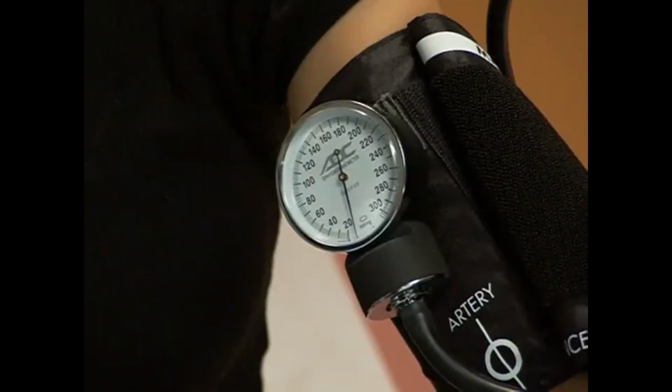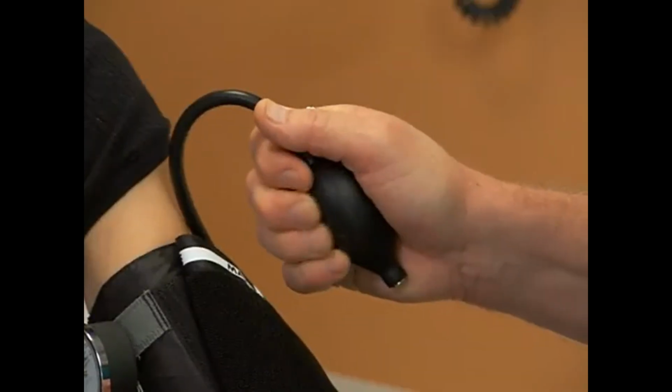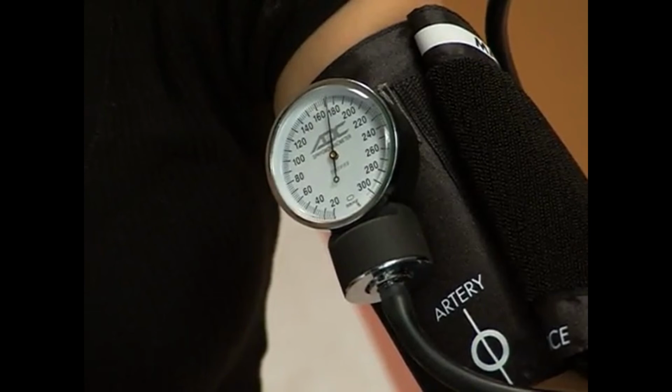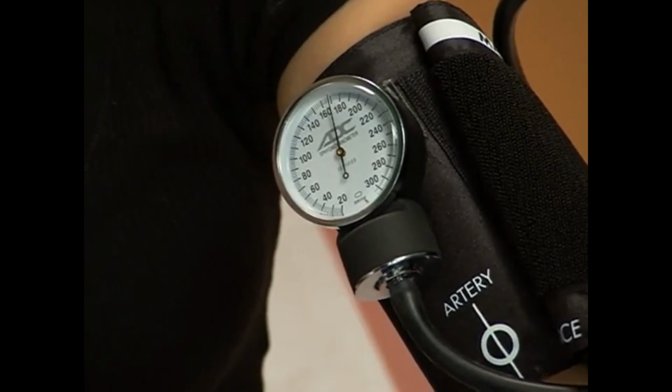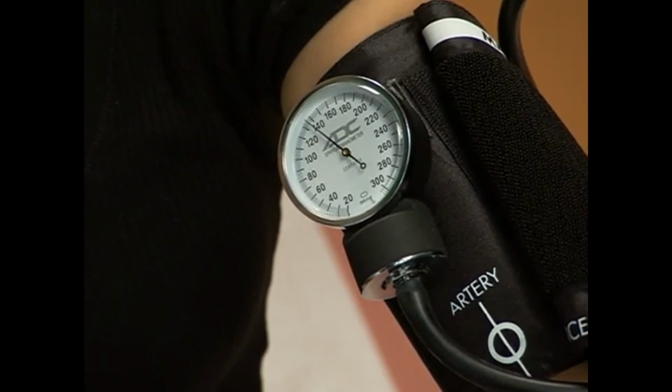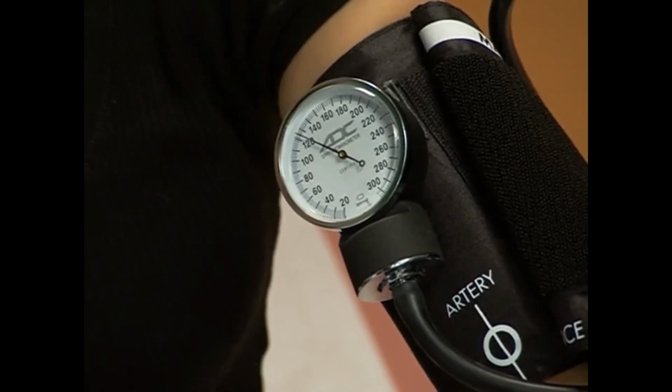Keeping your eyes on the gauge, quickly inflate the cuff to 20 to 30 millimeters of mercury above the estimated systolic BP. Slowly deflate the cuff at a rate of about 2 to 3 millimeters of mercury per second as you listen for pulse sounds. You will hear the first Korotkov sound when the gauge coincides with the client's systolic BP.